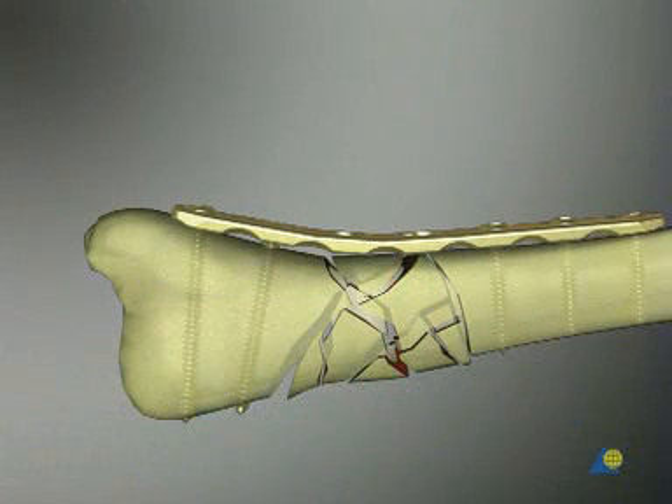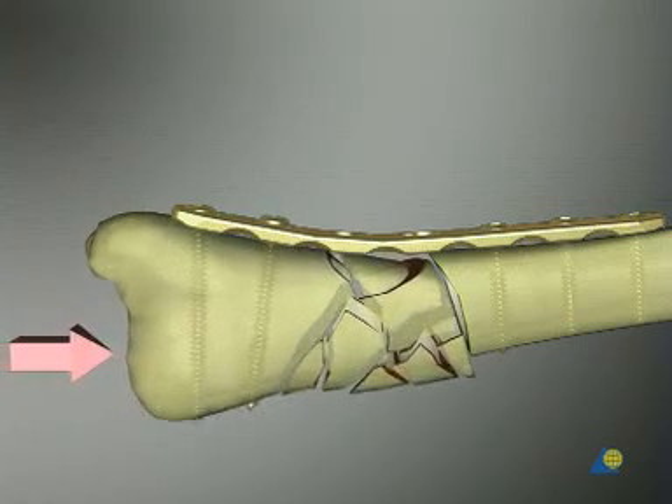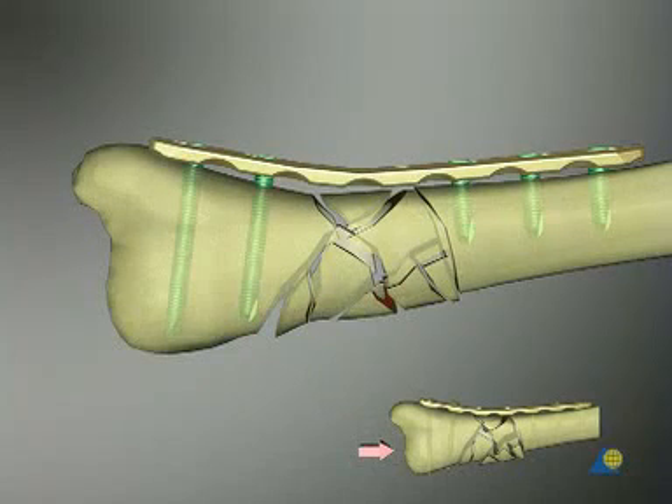If fractures close to a joint are stabilized with conventional non-locking screw and plate systems, there is a danger of a secondary loss of reduction due to successive loosening of individual screws in the section close to the joint. The main feature of the internal fixator principle is the locking head screws, which provide angular stability. Upon loading, these screws anchored in the plate do not loosen or pull out, therefore preventing secondary deformity or collapse.